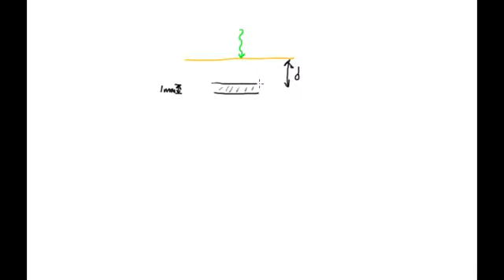Actually, these chambers are a little bit more complicated, because you have an electrode around here on either side that's a ring. That's called a guard ring, and it has a corresponding electrode down here. And that is at the same voltage as this one. The result is that you end up having a collection area just under this inner ring, and you don't collect the charge around the outer guard ring electrodes, and that gives you a better determination of the volume.